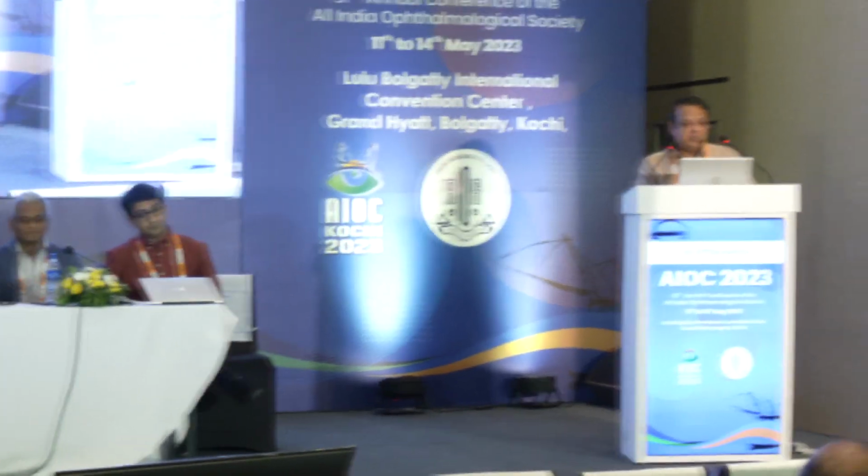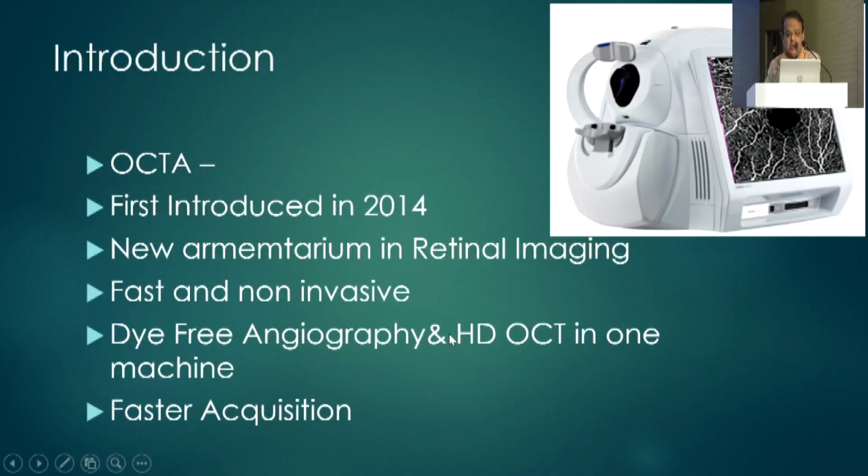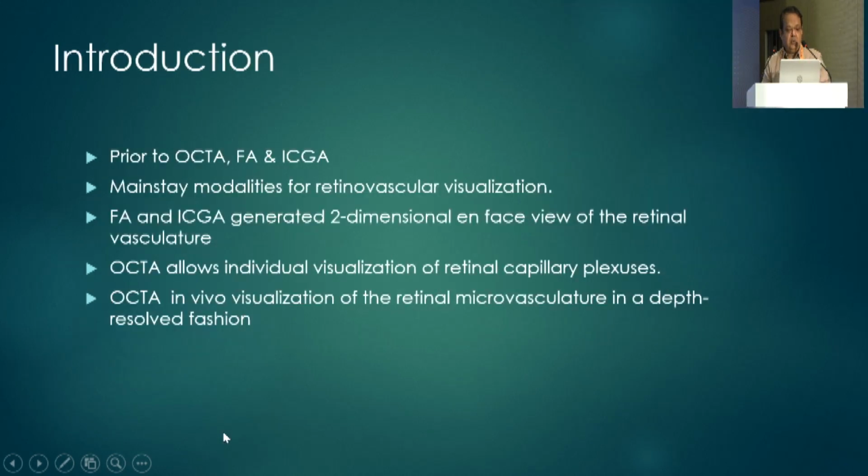Move to the next talk, that is OCT interpretations and artifacts. OCTA was first introduced in 2014. It's a new armamentarium in retinal imaging: fast and non-invasive, dye-free angiography with faster acquisition. Prior to OCTA, FA and ICG were the mainstay modalities for retinovascular visualization.